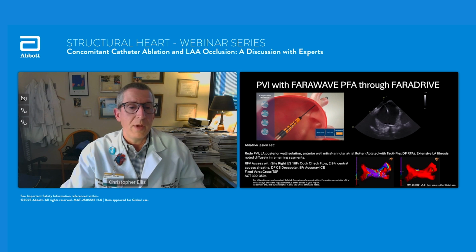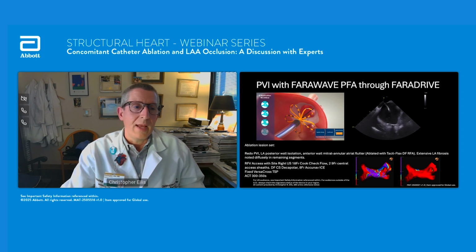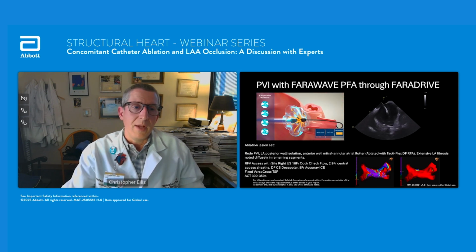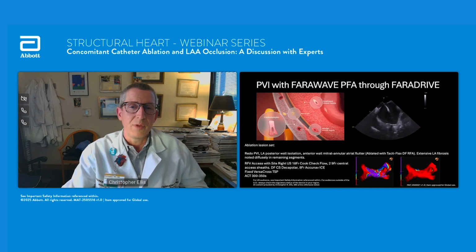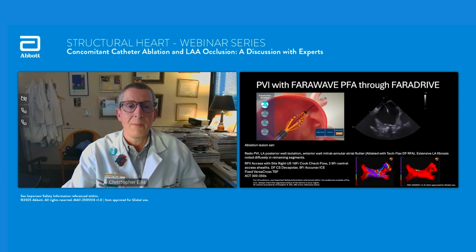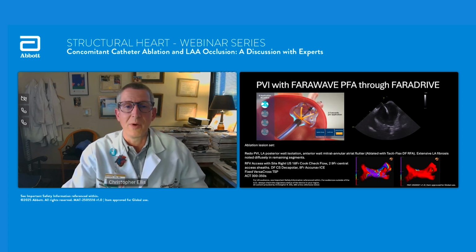So my workflow on PFA, I've been trying to hybridize. I'm not comfortable enough yet with zero fluoro PFA. It's been hard because so many times I'm using a system other than Opal with ESI, and I can't confidently say without looking on fluoro that I don't have a spline inverted. It happens: if the catheter acts funny, you see more micro bubbles, and it flips a little bit on the map back and forth, and it doesn't behave as fluidly as when we were doing zero fluoro with CARTO and point by point. I literally didn't wear lead doing an AFib ablation for almost a decade. So that's the one thing that I still am annoyed by with pulsed field, although the procedures are so much faster that you're not wearing lead that long.